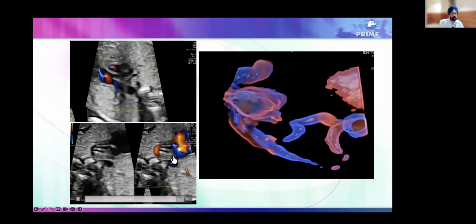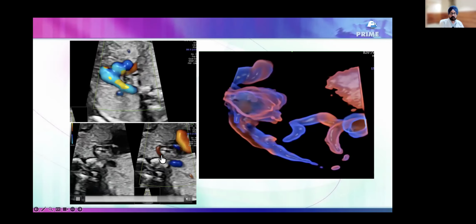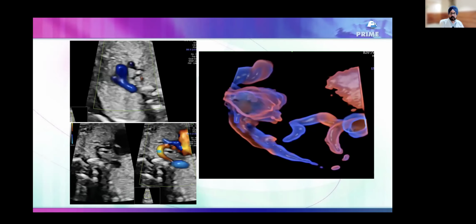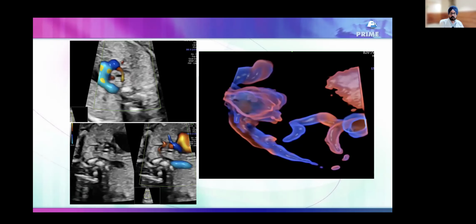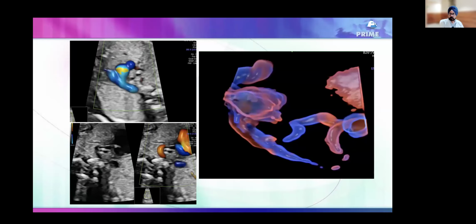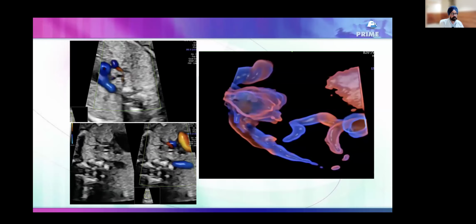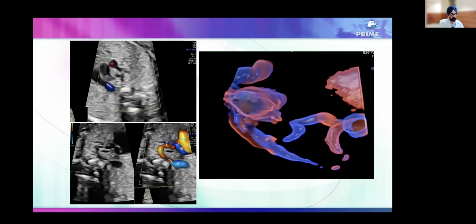That's the thing you need to know: azygos, which is normal, and normal size should be less than 1/4 the size of the aorta, because the azygos and hemiazygos systems are developed to drain the venous flow from the chest cavity, not the lungs, but the chest. The hemiazygos and azygos drain the blood into the SVC.